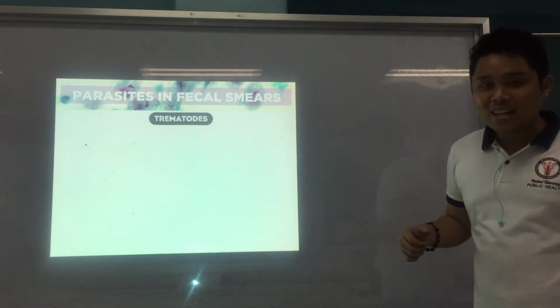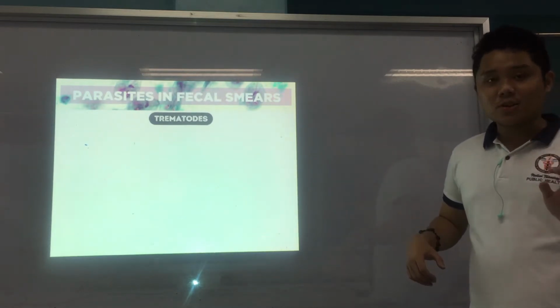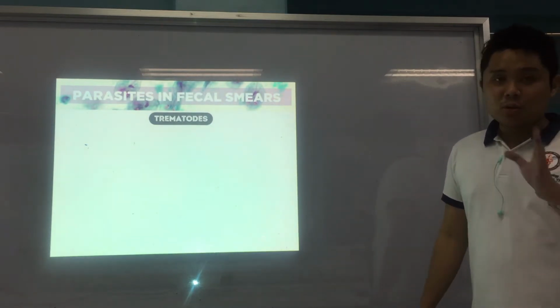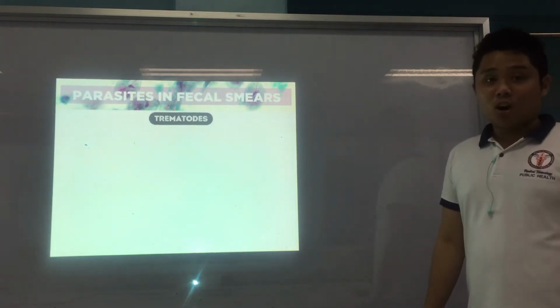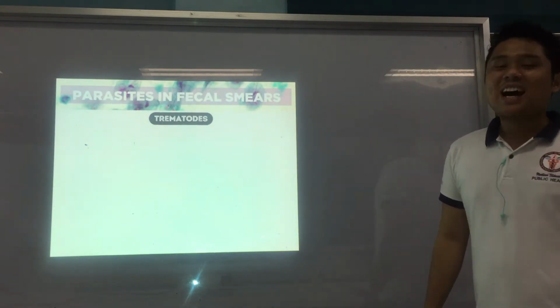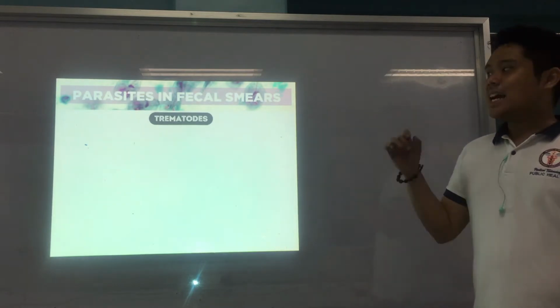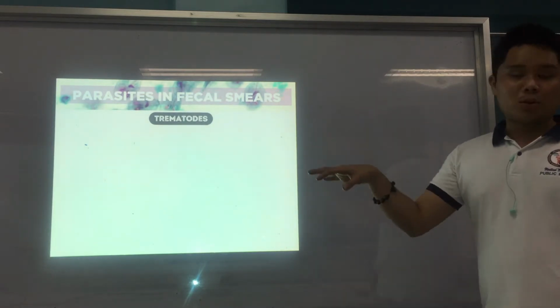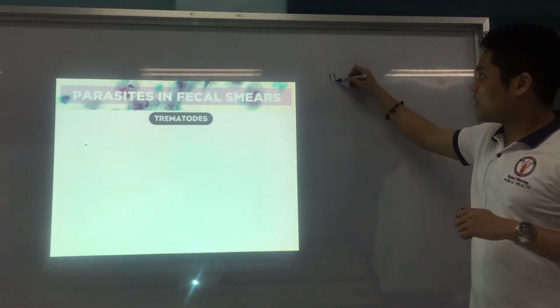And we have already finished the nematodes. Again, medyo marami, but the ones that I included are the most common that you can recover in our lab class, in the hospitals. But again, there are a lot of nematodes pa. There are a lot of roundworm parasites, and again, you'll have that in your lecture. Okay? Alright, now before we continue with trematodes, guys, again, I'll just emphasize for hookworm and strongy.